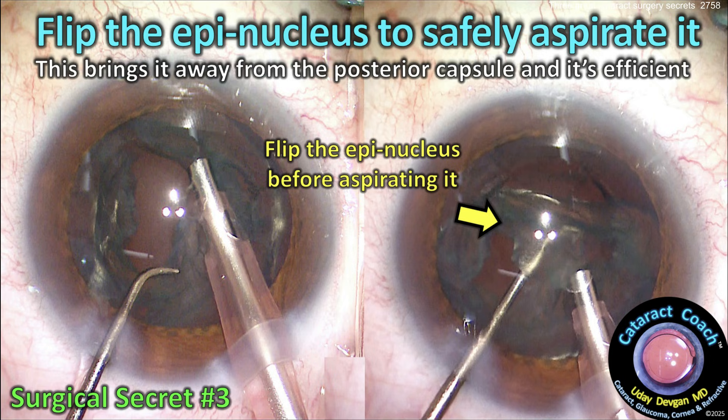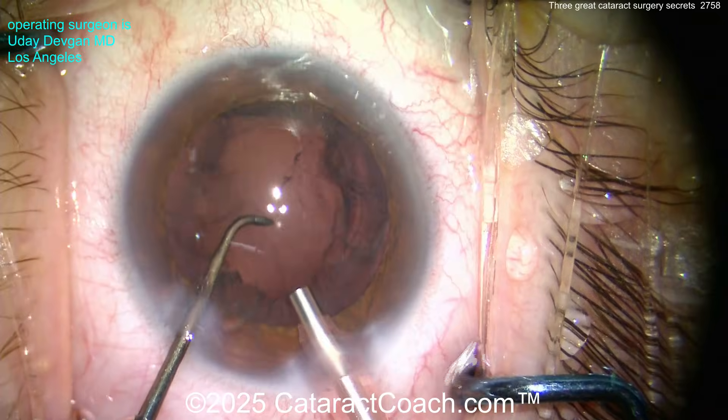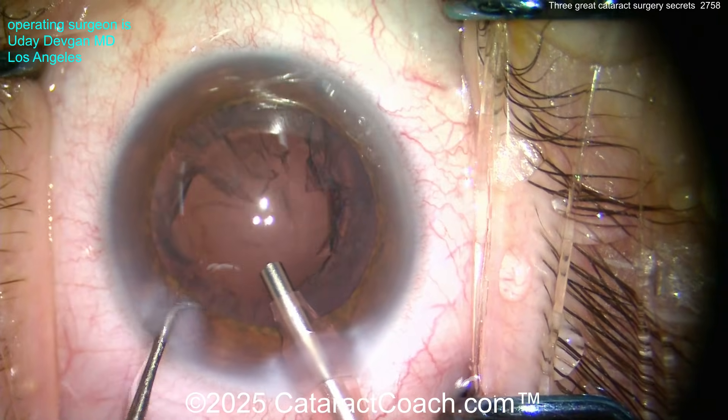Flipping up that epinuclear shell upside down makes it easy to safely aspirate. It's also very efficient and it protects your posterior capsule. At the end of the case it's cleaned up pretty nicely.